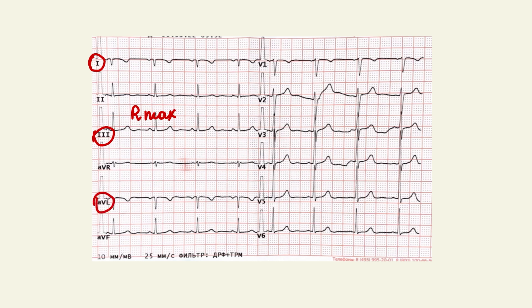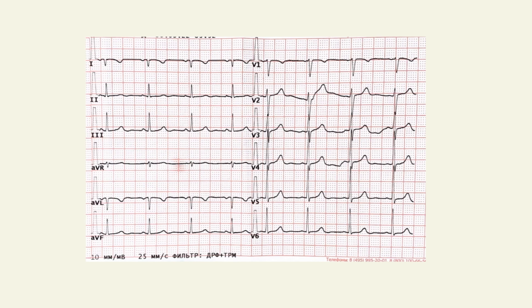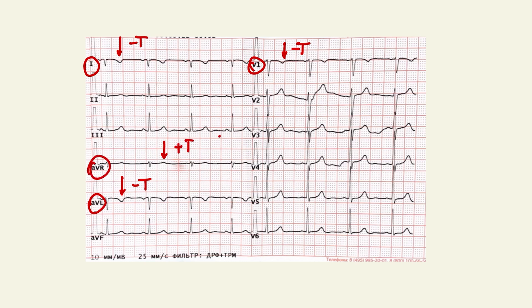Look at lead AVL — a similar situation. Now look at the T wave. We see a negative T wave at lead 1, lead AVL, and at lead V1. And a positive T wave at lead AVR. At lead AVR, the T wave should always be negative.